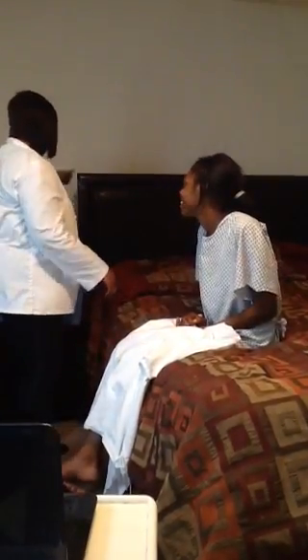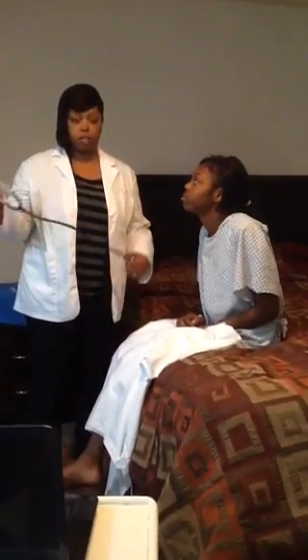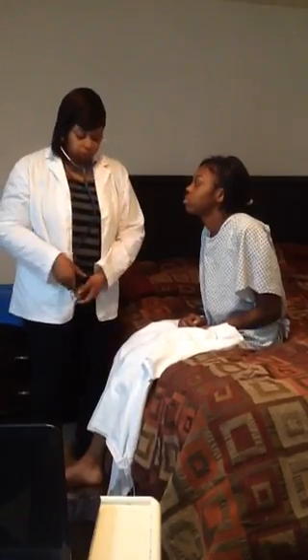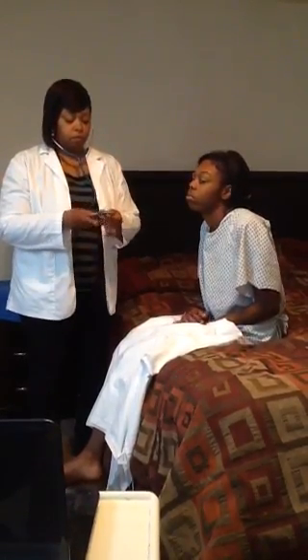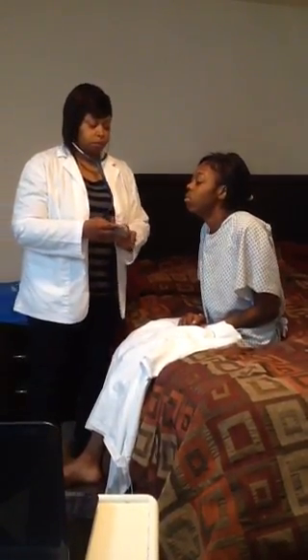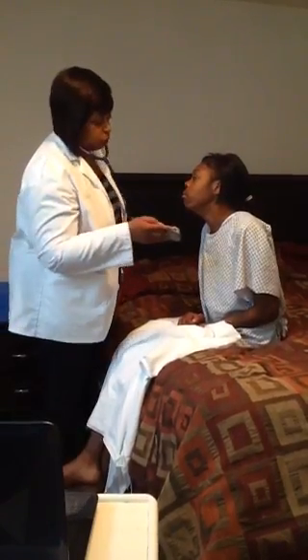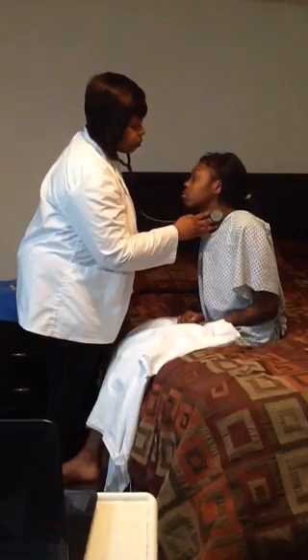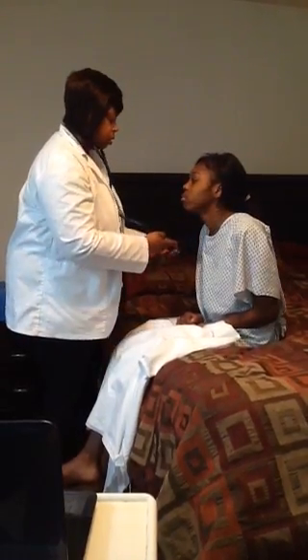Now I'm going to auscultate the carotid arteries using the bell of my stethoscope, one at a time. Can you hold your breath for me? Good. Exhale.